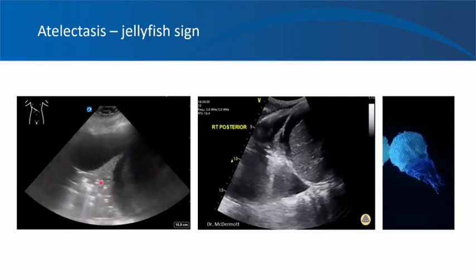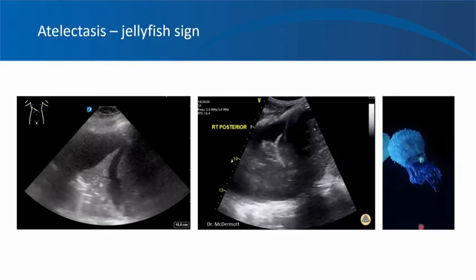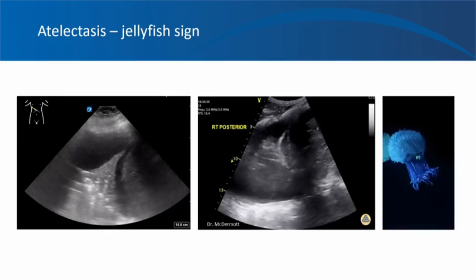And sometimes this atelectatic lung, the way it moves in the surrounding pleural fluid, it feels as if a jellyfish is swimming in the water. So that's also called the jellyfish sign, or sometimes it's also called lung flapping.